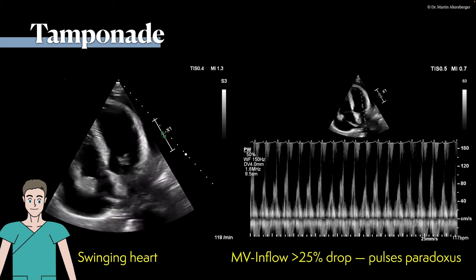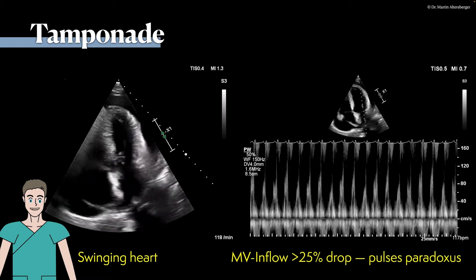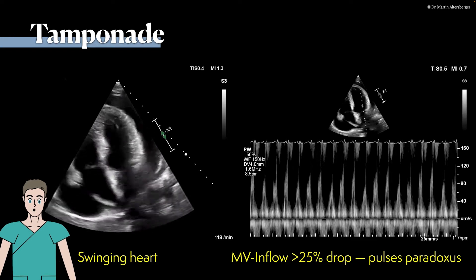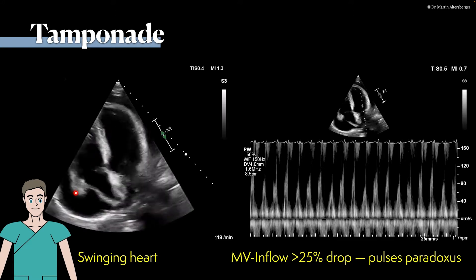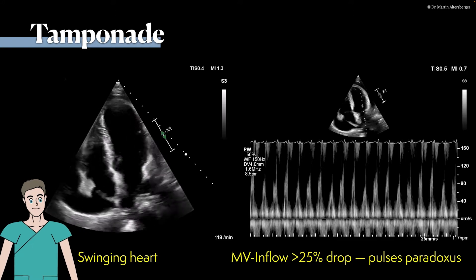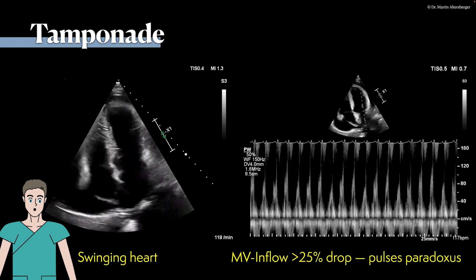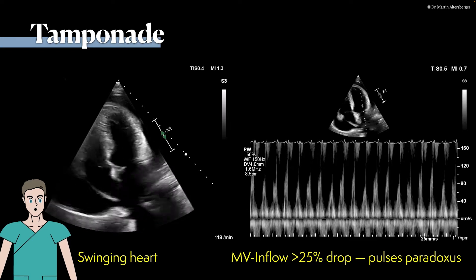The patient was hemodynamically unstable. We see that the right atrial walls are compressed, and partly the free wall of the right ventricle is also not able to fully dilate during diastole. Per definition in echocardiography, that defines tamponade. It was a very young patient with an oncological diagnosis. If you see a swinging heart and a dilated inferior vena cava, that is definitely a hemodynamically relevant pericardial effusion.